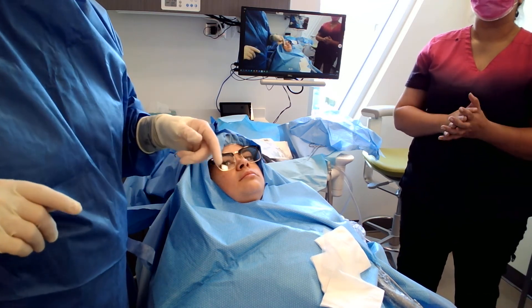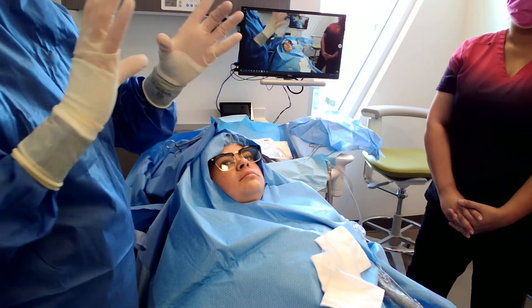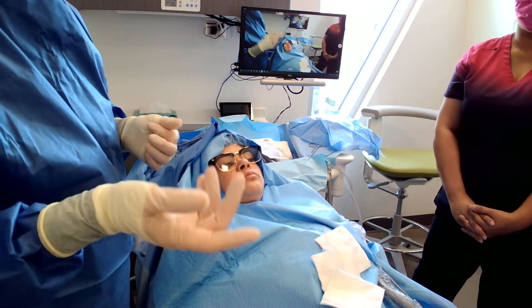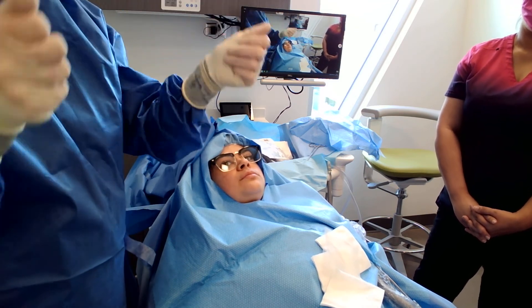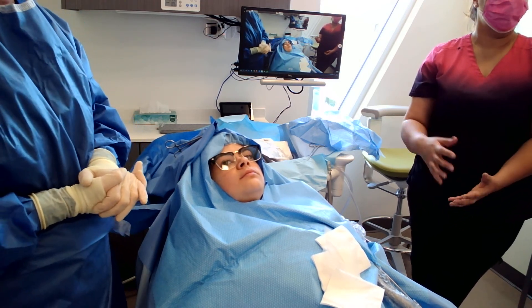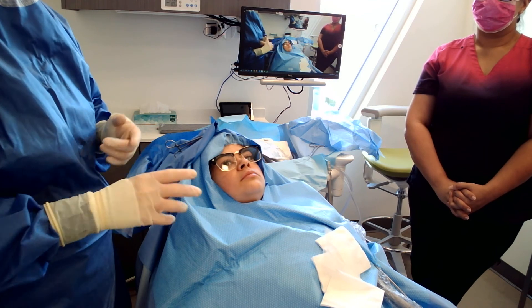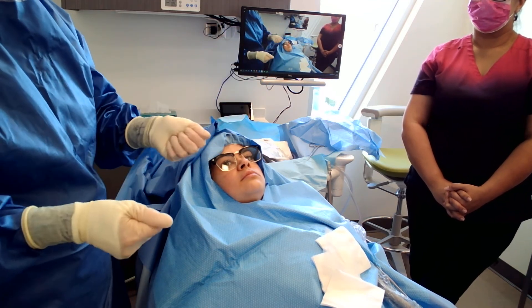What we're doing now is taking blood products. If we're starting an IV, we do it right at the IV start and fill up a few CCs of the patient's own blood — usually a couple of different vials. We run it through a centrifuge, it separates the blood, and forms the patient's own membranes. So instead of using a collagen membrane out of a box, it's from the patient's own body. Membranes cover over the surgical site before we close the flap. That's PRF — they look like little slugs when they separate. They can either go into the socket or be flattened over the site. I always have my bone bucket in every surgical case, even extractions.